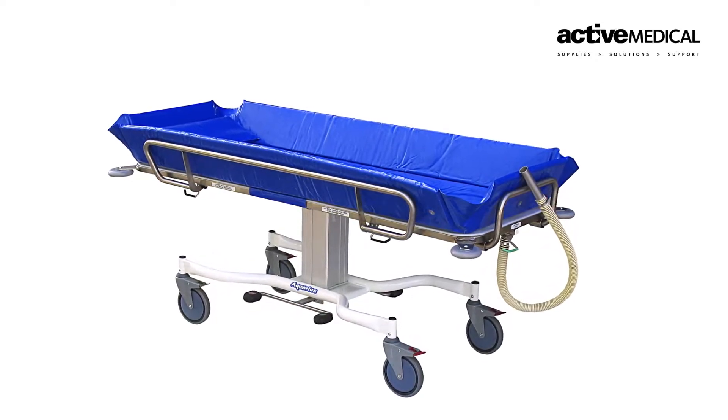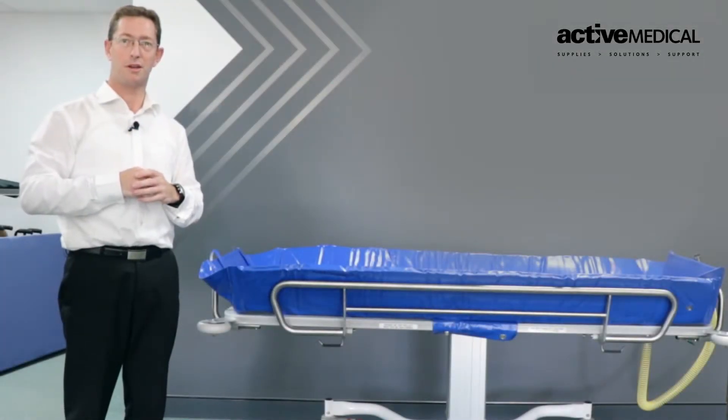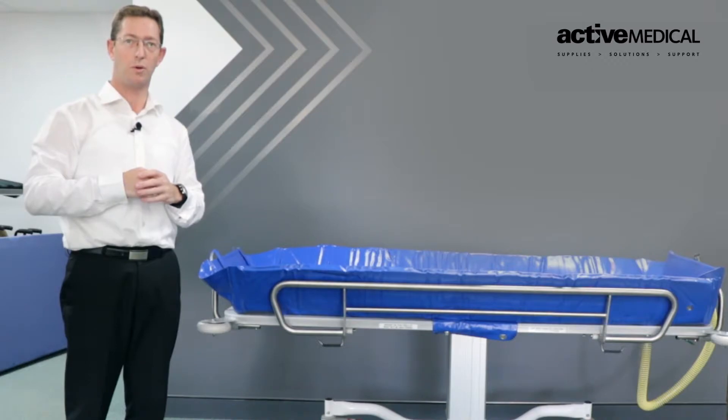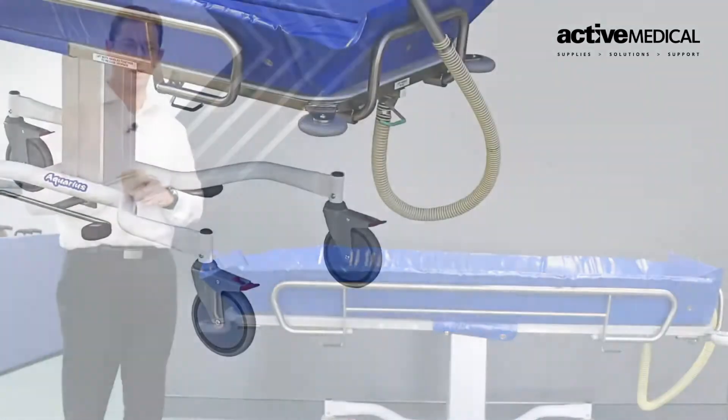Firstly, we'll start with the casters — a 175mm caster with a specialized rubber coating to ensure they have good grip in a wet environment. Being a shower trolley, this will always be used in a wet area, and this is quite critical.